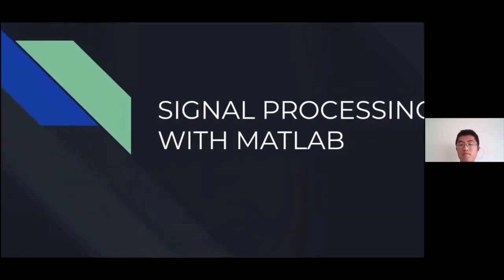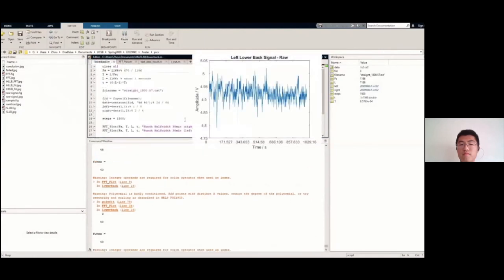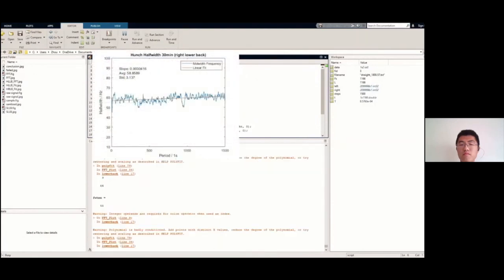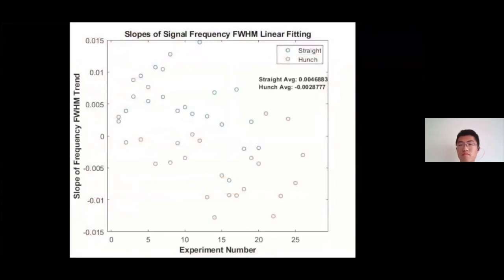The next step is about the signal processing with the MATLAB. The function of this MATLAB script is to extract data from the original text file. The fast Fourier transform results will be generated, and the full width at half maximum values will be calculated to show the shifting trend of frequency. After plot out all the slopes in one diagram, you can obviously see the fatigue level difference between two postures and make a conclusion.